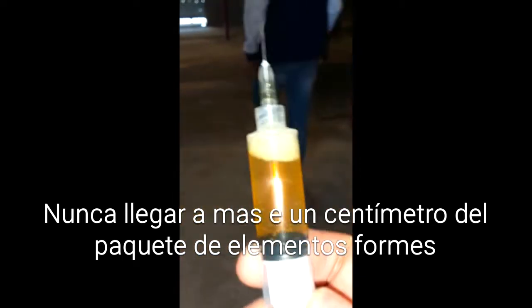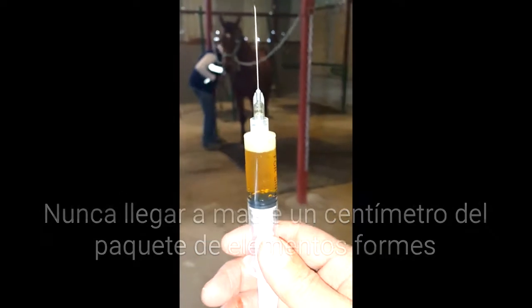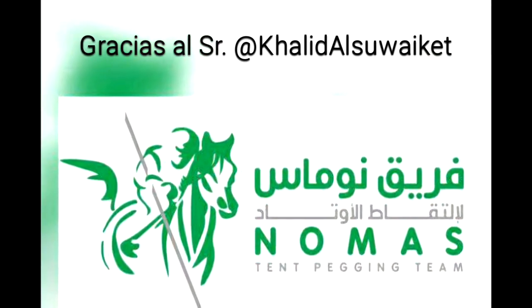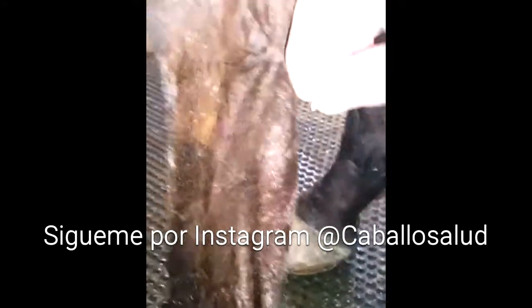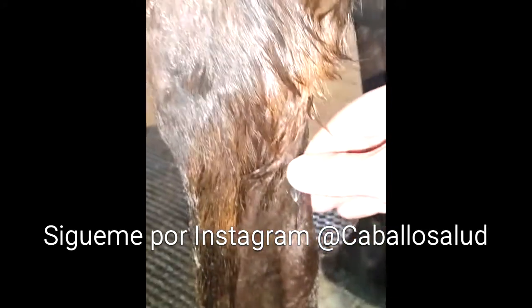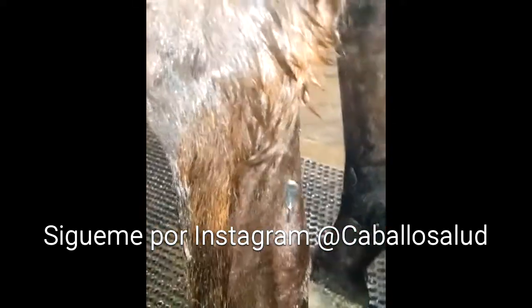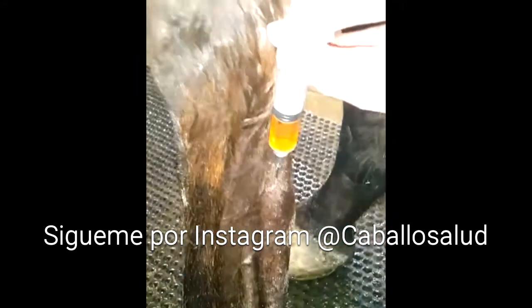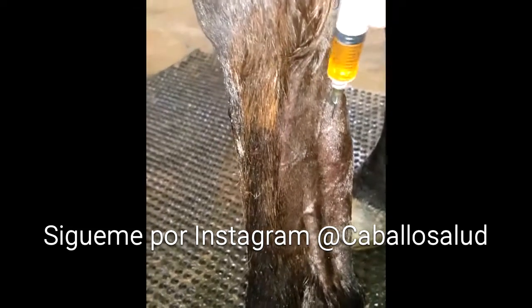Si lo tocas vas a crear una reacción inflamatoria. Este es el plasma, esto es lo que voy a inyectar en el tendón que está roto. Con todo el cuidado, meto en la lesión y ahora voy a regar el plasma dentro de la sede de la lesión.